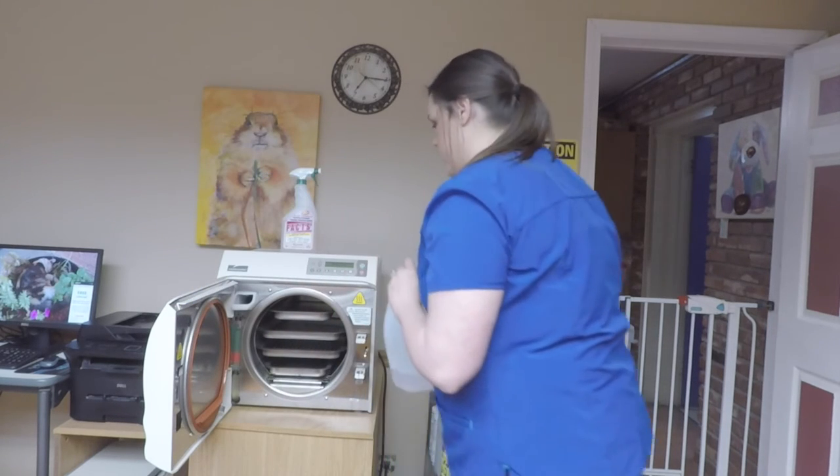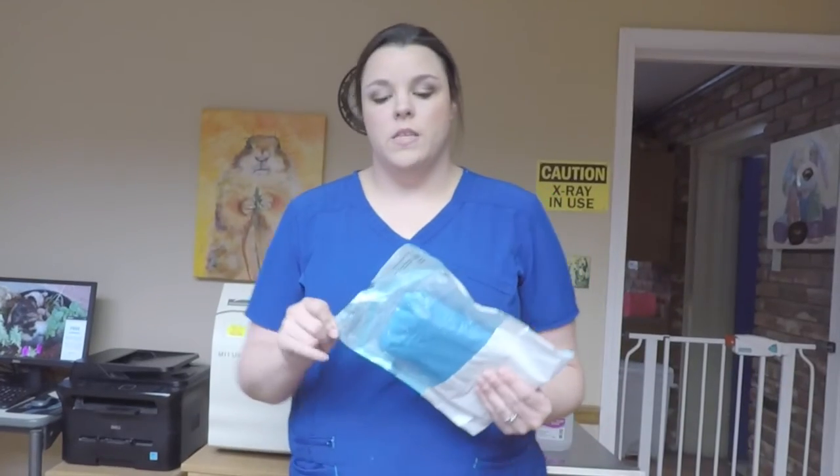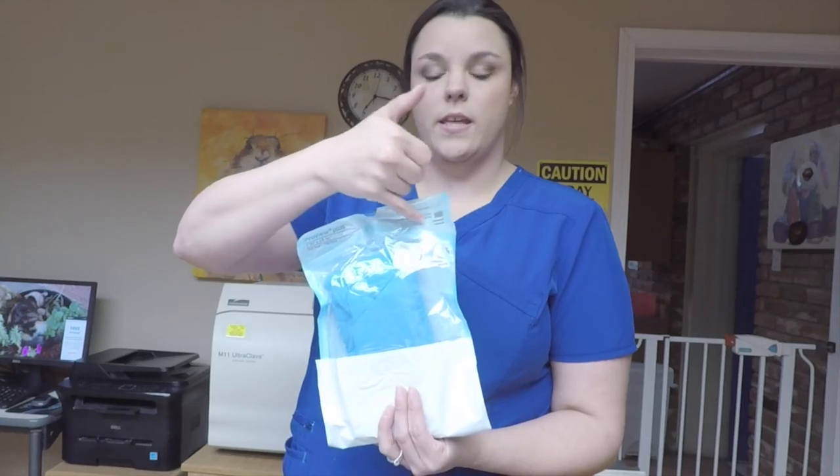And then once it's well into the green area, you are ready to use it again. Okay, this is a spay pack that we just did. The way to tell if it is sterile or not, there is a color changing indicator on each of these sleeves, and it'll turn brown when the pack is sterile.